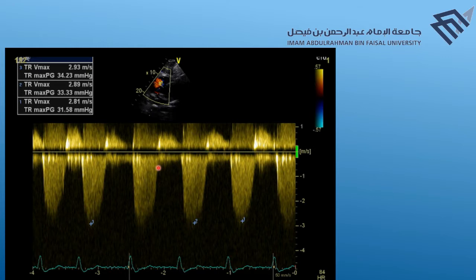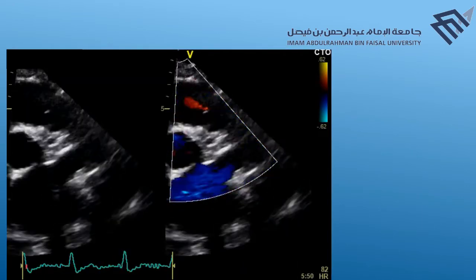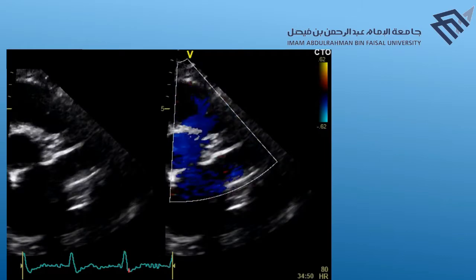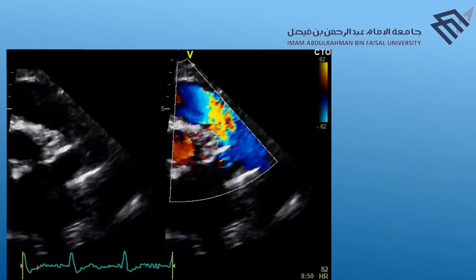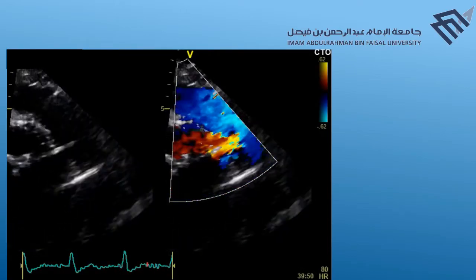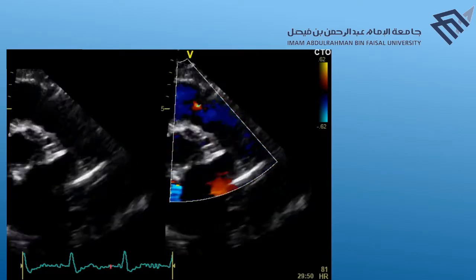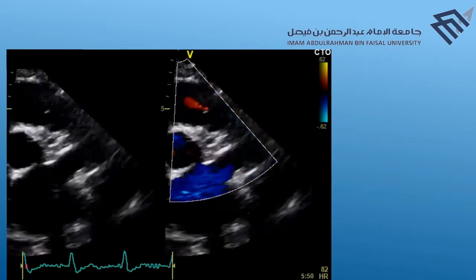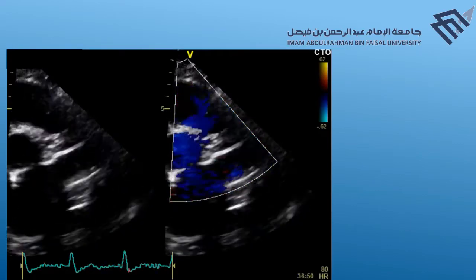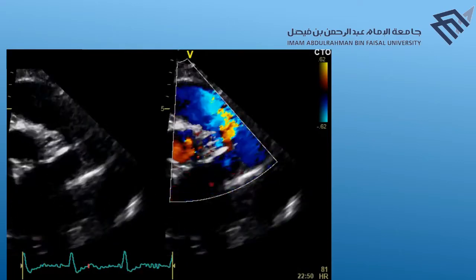So the question here, since we have contradicting measurements of the tricuspid regurgitation jet, is can we measure it some other way, utilizing some different jets? The answer is definitely yes. We have many ways to do it. One of the ways is through measuring acceleration time through the pulmonary artery, just proximal to the pulmonary valve. Here we can note in this parasternal short axis view that there is some turbulence across the pulmonary valve, and there is a physiological regurgitation jet.